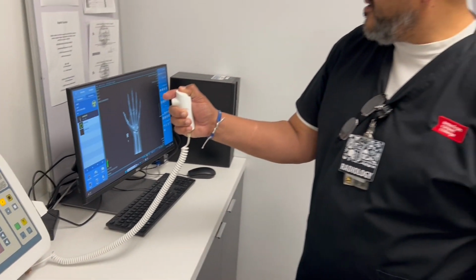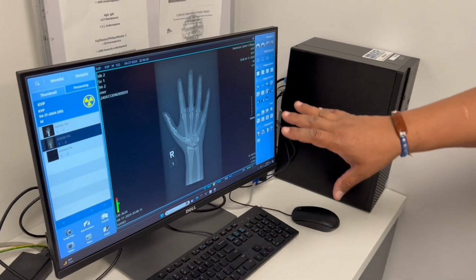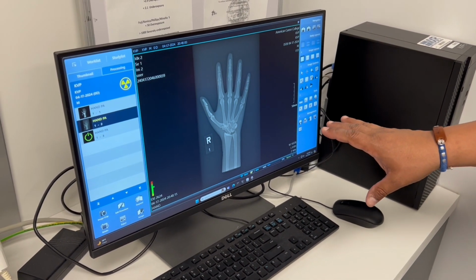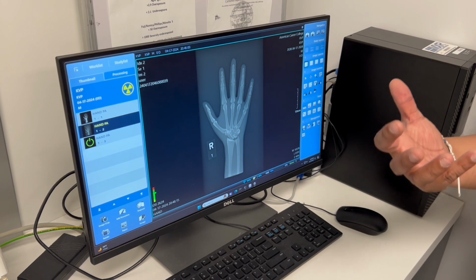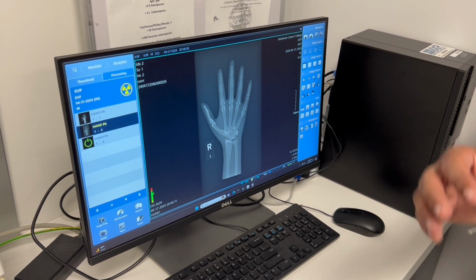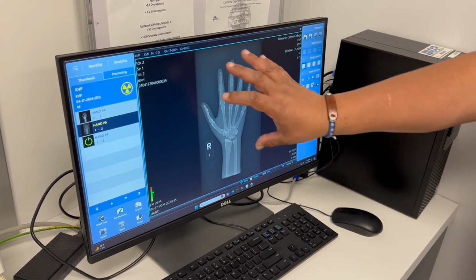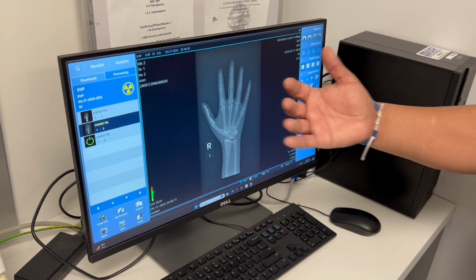All right, X-ray clear. Okay. Now take a look here, you guys. You definitely can see how the grayscale has changed. Because we went up in KVP, more of the photons are going through the object. That means more of the X-ray signal itself is going through the bone, going through the joints, and you're going to have more of the detector hit by exposure.